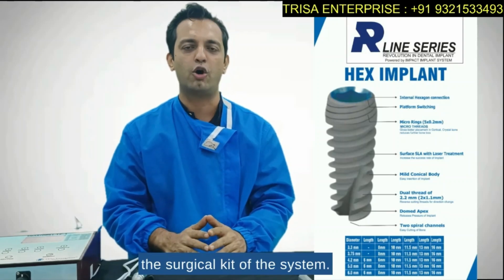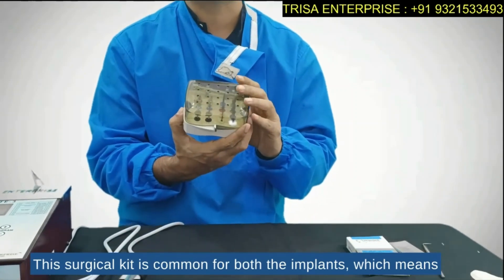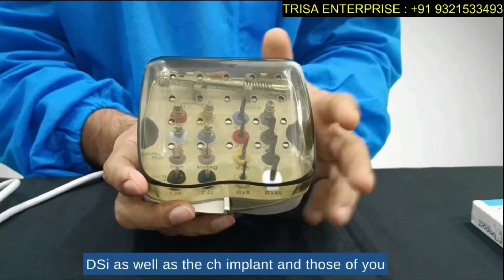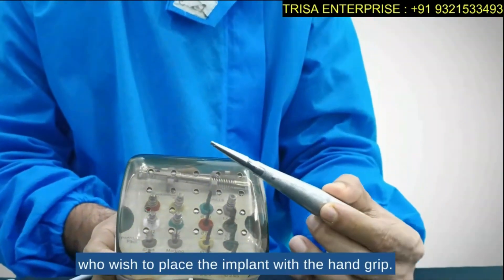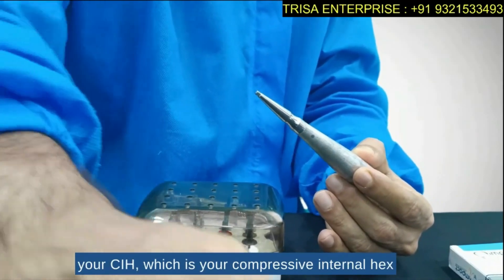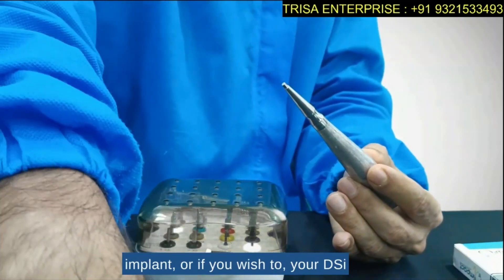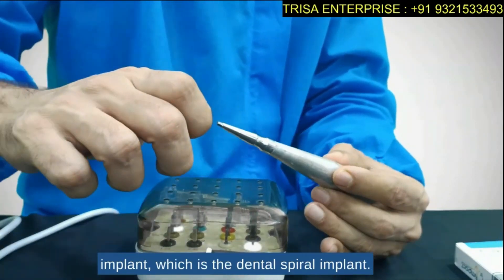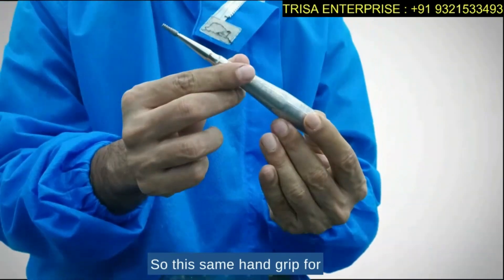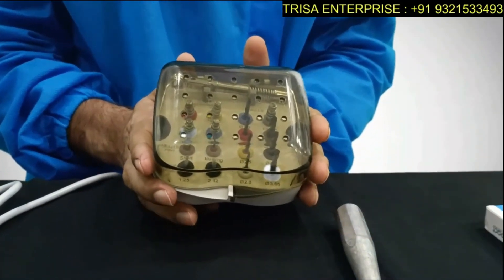More interestingly, let me show you the surgical kit of the system. This surgical kit is common for both implants, meaning with this one kit you can place both the DSI and the CIH implant. This same hand grip is useful for both the CIH (Compressive Internal Hex) implant and the DSI (Dental Spiral Implant) — that is another unique feature of this system.